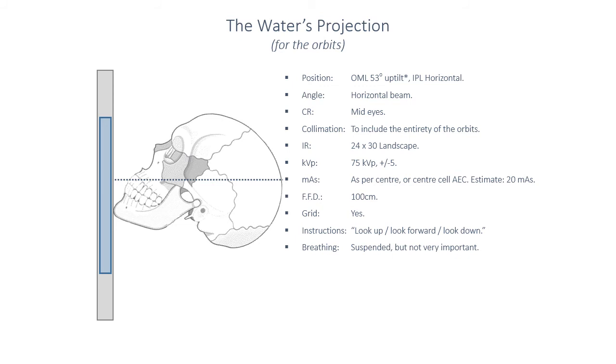The position of a known or queried foreign body within the globe will vary depending upon the depth of that foreign body and the extent to which the patient has been able to change their gaze. So it does require a fair amount of patient compliance, and as such I encourage you to coach and communicate with the patient well.